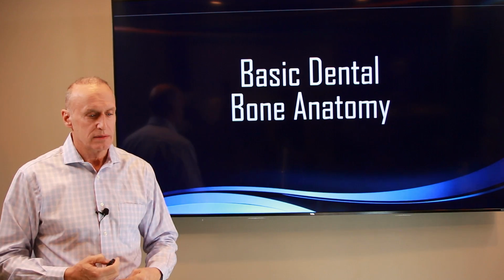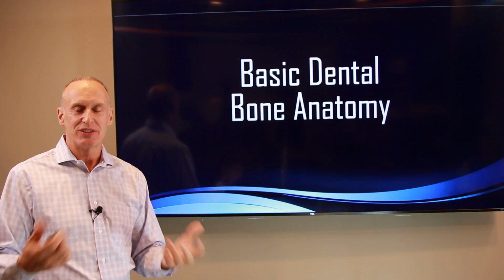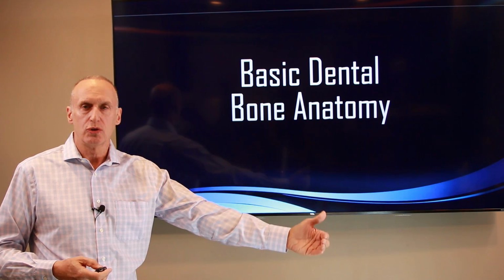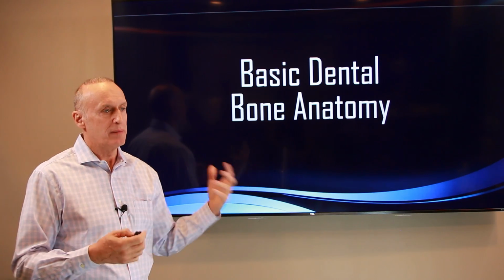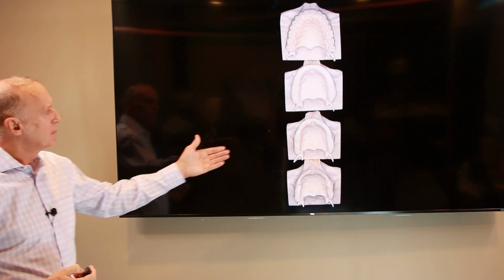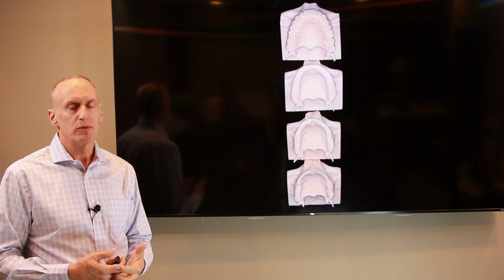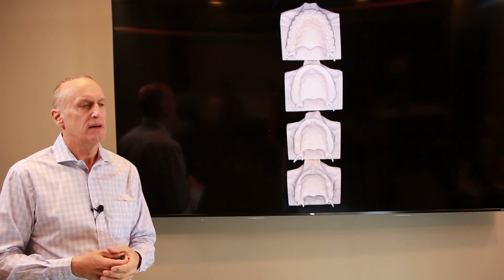So I'll stop ranting for a while and I'll start showing you and educating you on some of the things I think you need to know going into this huge, perhaps the biggest decision you've made in your life about fixing your teeth. So I have these bone resorption models that I keep at my desk and I show patients. Many times people don't know why their dentures get loose or why their mouth appears to be sunken in after many years of denture wearing.